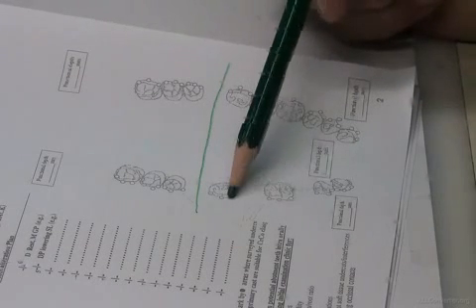For a clasp here, I could eliminate clasps here and here because I have multiple abutments on one side. This is another reason for minimization. If two abutments are adjacent, I could eliminate retentive arms. Also, I could make double rests.